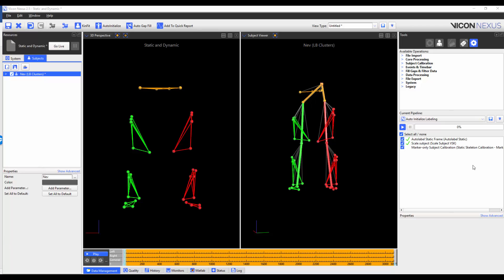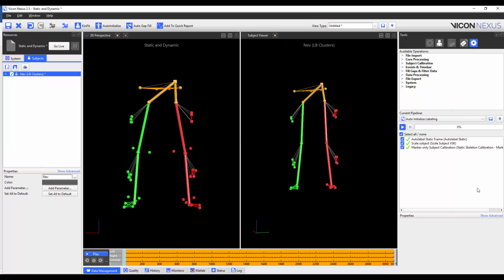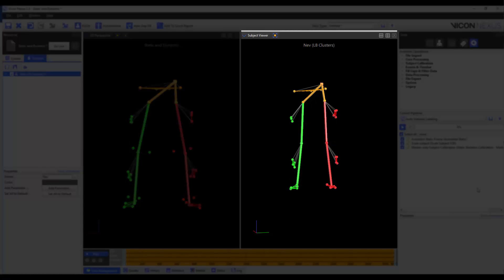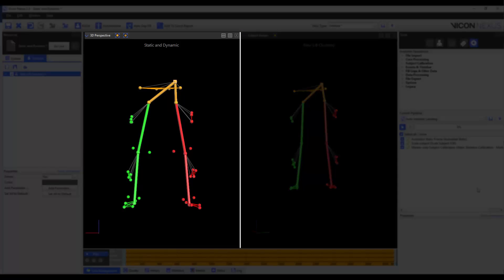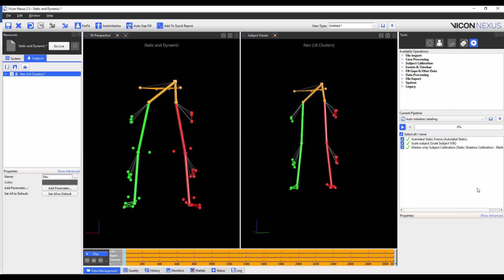The final step in the pipeline is to use the markers only subject calibration pipeline operation. We are using the markers only subject calibration because the joint locations in the model were already optimized when we built the VST. And so all we need to do is to reposition the markers in the VSK. After the operation has been run, we can see that the markers have been repositioned in the subject viewer, but that the segments and joints have stayed in the same position. We can see that the segments and joints have appeared in the 3D perspective. I'm also expecting this calibration to provide good auto labeling, as the joint centers are roughly where they should be functionally.